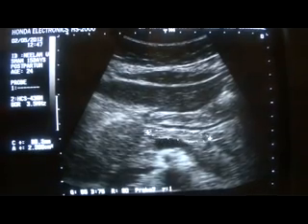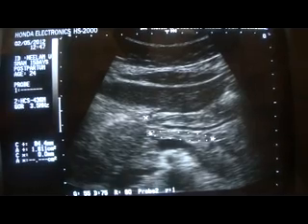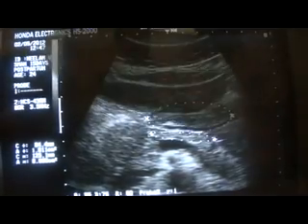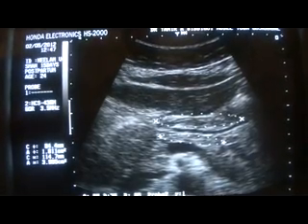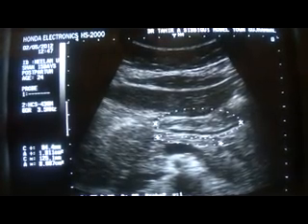Whenever you see such a structure, always give a 90-degree angle sweep, and you will see that the same area that you were seeing has taken the shape of an echogenic area surrounded by a hypoechoic area. This is the wall of the bowel, which is the duodenum.